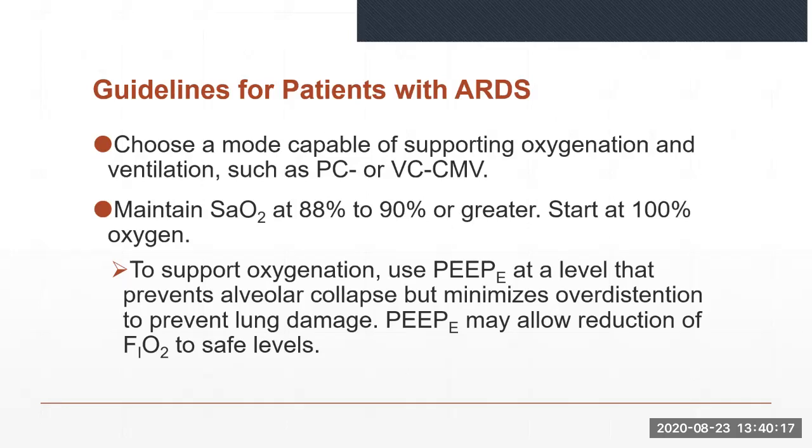patients. As discussed in earlier chapters, it is important to remember that the use of high respiratory rates and low tidal volume may not provide sufficient time for exhalation and ultimately lead to air being trapped in the lungs during exhalation, such as auto-PEEP. The following are guidelines that are suggested for ventilating patients with ARDS.